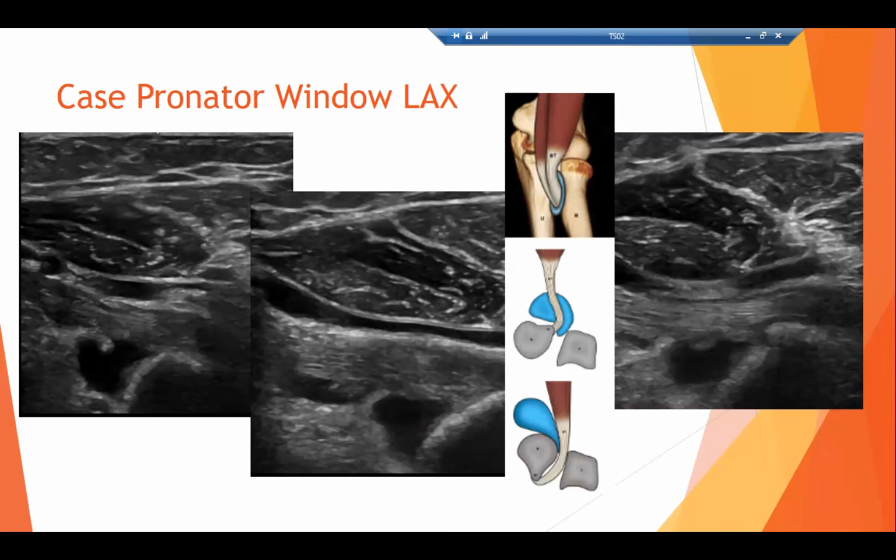So trying to figure out where things are from a dynamic standpoint can be helpful, because you can have these pseudotumors, these swollen synovial bursa complexes that probably won't ultimately go away with injection-based treatments, versus something like this where there's a lot more free fluid among the synovium. That might be a little more amenable to a non-surgical treatment.